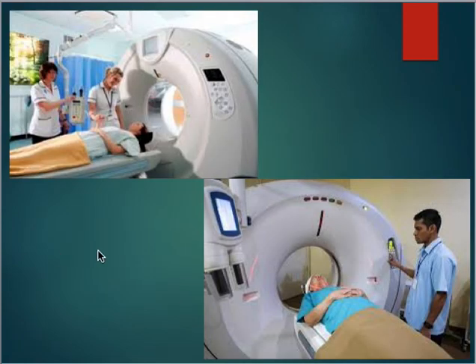These are two different modern CT scanners here. So you have the patient lie on the table. This gentleman over here is using the controls to raise and lower the table, bring the patient into the gantry. There's laser lines, you can kind of see one out here and on the patient here, that help to determine where you want to position the patient.